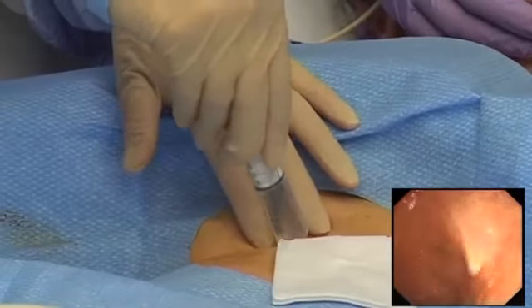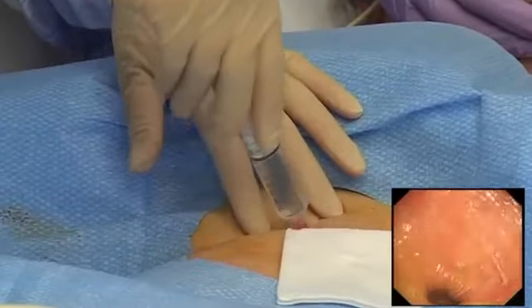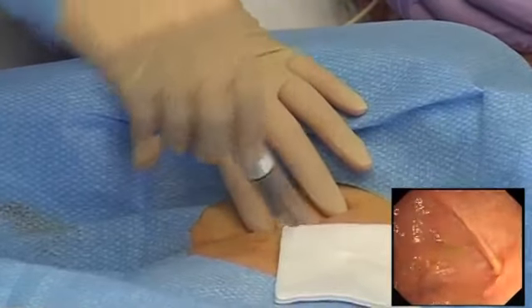Okay, there we go. It's the needle just coming through there. Just a bit short. That's fine. Happy with that?